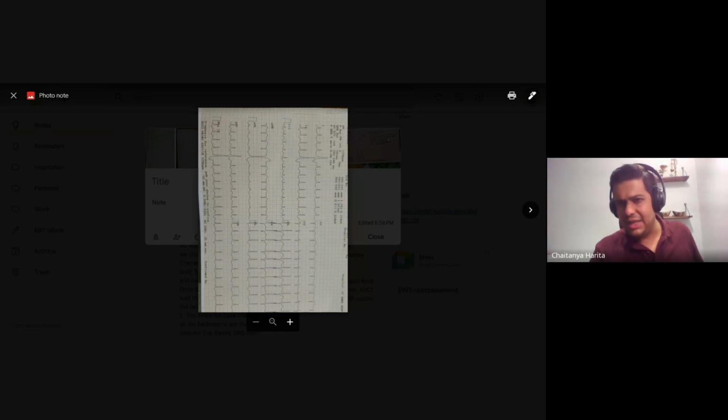If anybody else has any queries, any doubts, you can put your hands up and ask. As I said, ECG reading is an art, especially tachyarrhythmias, and ACS identification is quite difficult for most people. But if you follow the slides that I've put up and you just follow that pattern of ECG reading, you will never miss any finding.